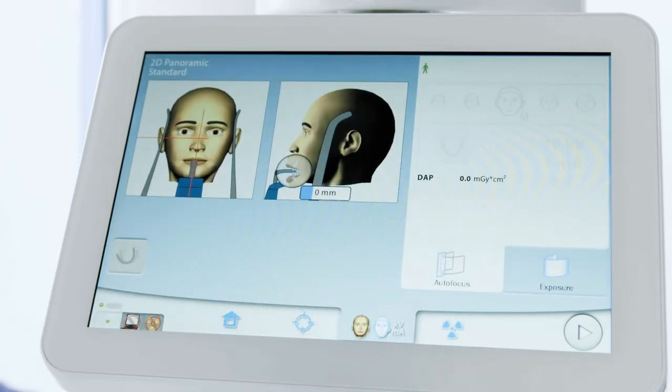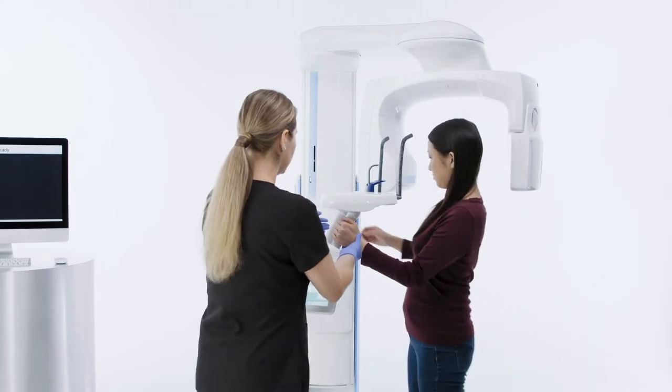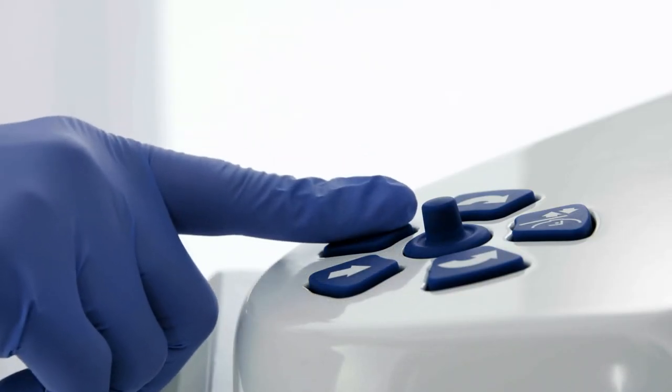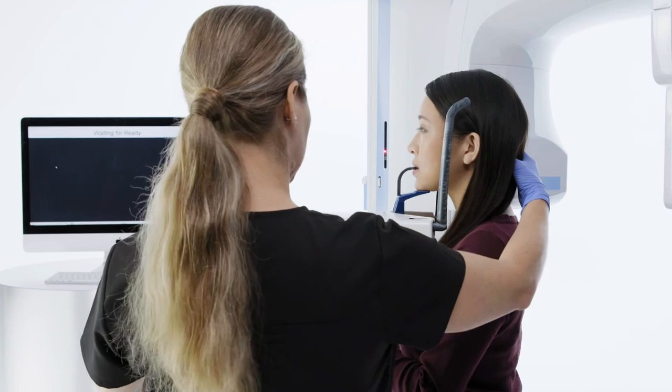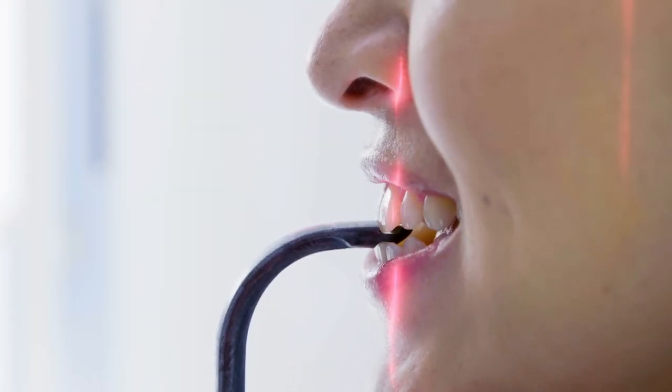Have the patient remove glasses, jewelry, all removable appliances, and hair accessories. Have the patient stand tall, hold the handles, and walk close to the unit to begin the positioning process. Adjust the height of the unit until the chin rest is even with the patient's chin.